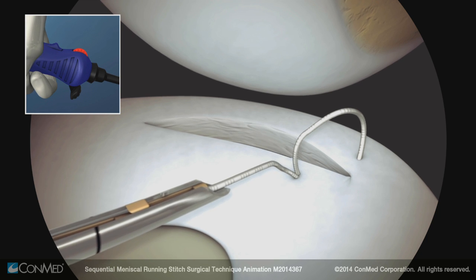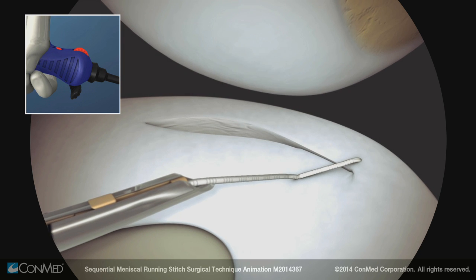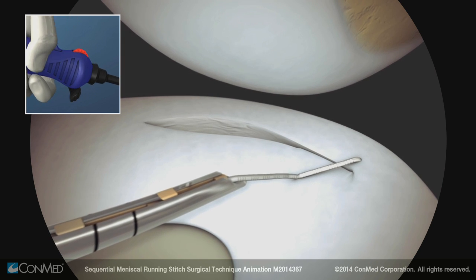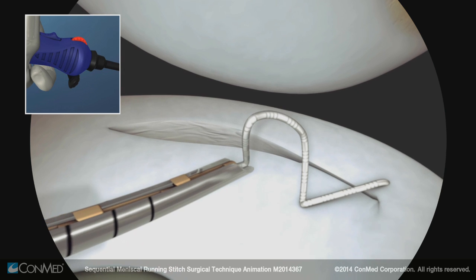Withdraw the needle from the meniscus. Move the switch into the ratchet position. Pull back to tighten the stitch and reel the suture in to remove excess slack. Move the switch into the freewheel position.